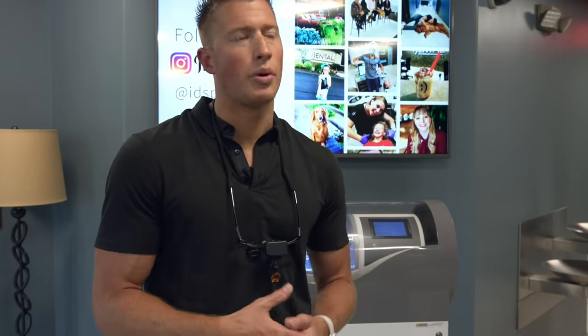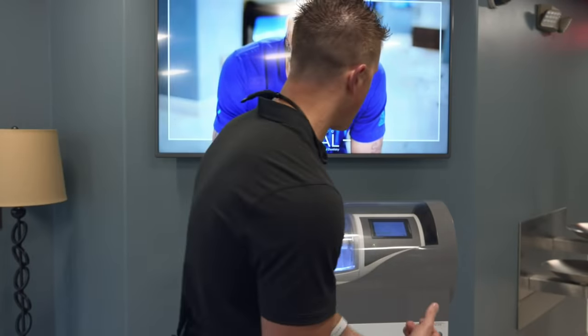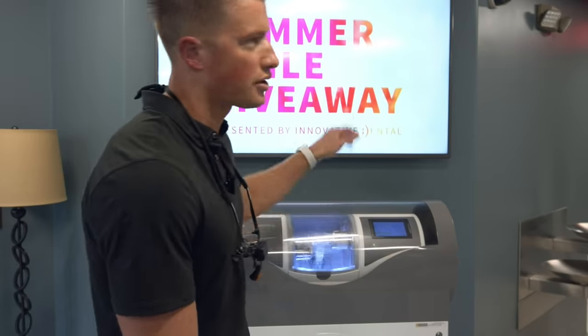And then it evolved to where we were able to start fabricating guides in office. The system to do that was not nearly as nice as it is now. So the ability that we have to create guides in our office like this, it takes about 25-30 minutes to mill it out. But typically what we do is plan all this and mill this out at night when I leave. So I'll come over here and start this when I leave the office. And then the next day, if the patient's coming back in, or the next week, we'll have the guide ready to place. So the patient's appointments are very, very short to place an implant, which, who doesn't love that?